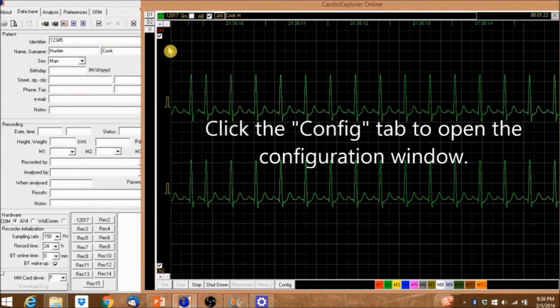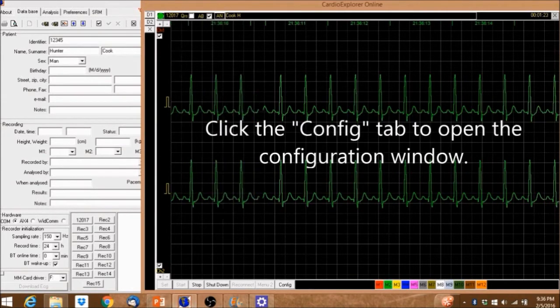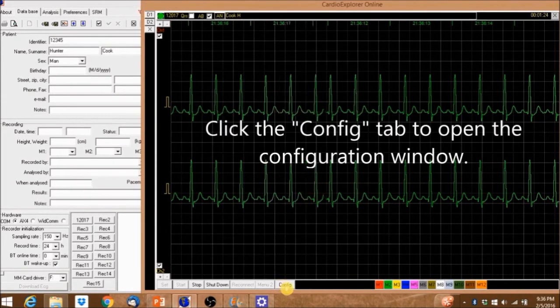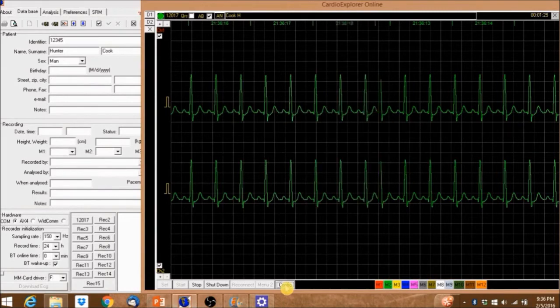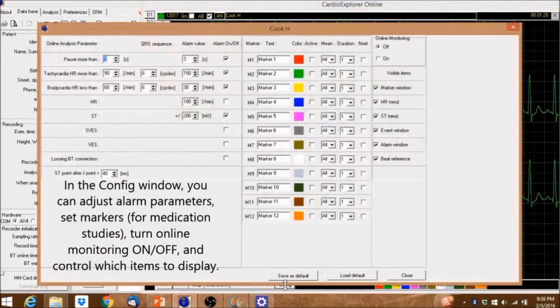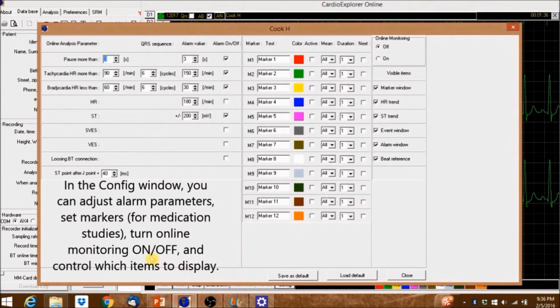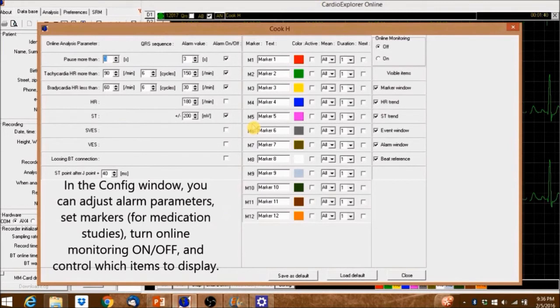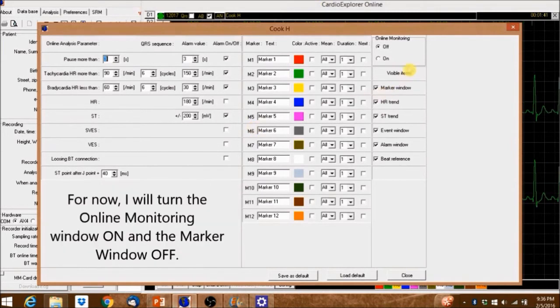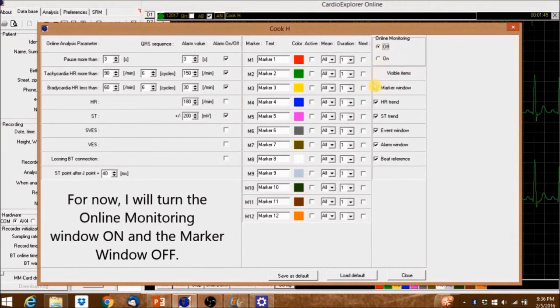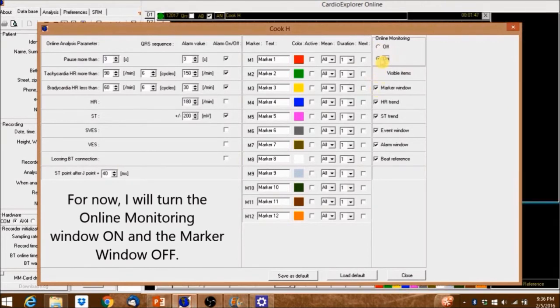Click the Config tab to open the configuration window. In the Config window, you can adjust alarm parameters, set markers for medication studies, turn online monitoring on and off, and control which items to display. For now, I'll turn the online monitoring window on and the marker window off.